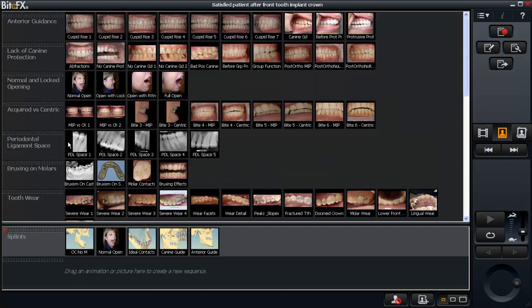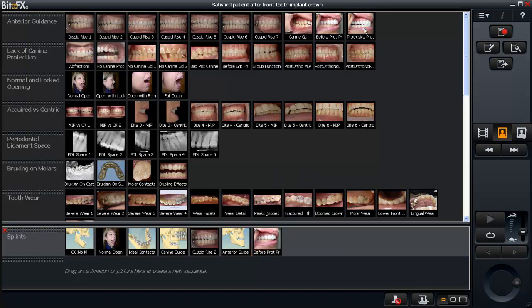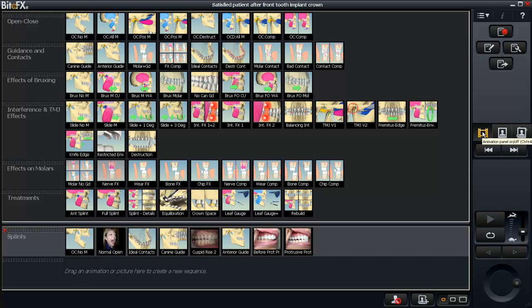Under canine guidance I'll get this one here — cuspid rise. Pull that down and put it right behind canine guidance. With anterior guidance, I'm going to add a picture there to show someone biting in their natural bite and sliding into protrusion. I'll go back to my animations and show the muscles in a stable bite, how they function.